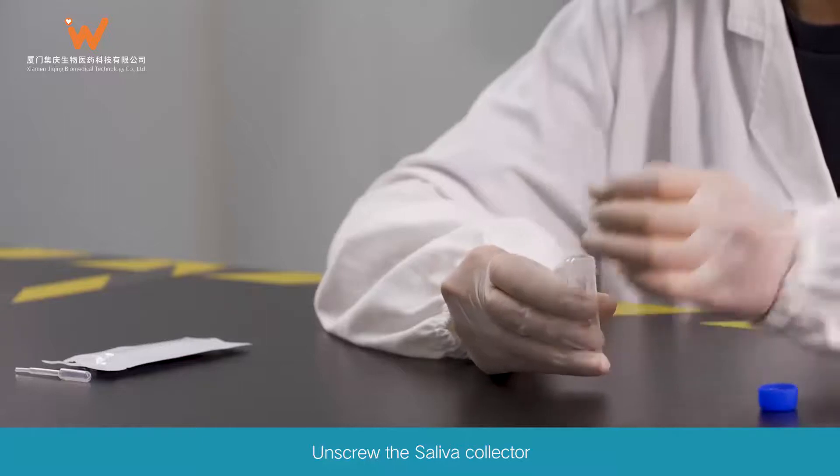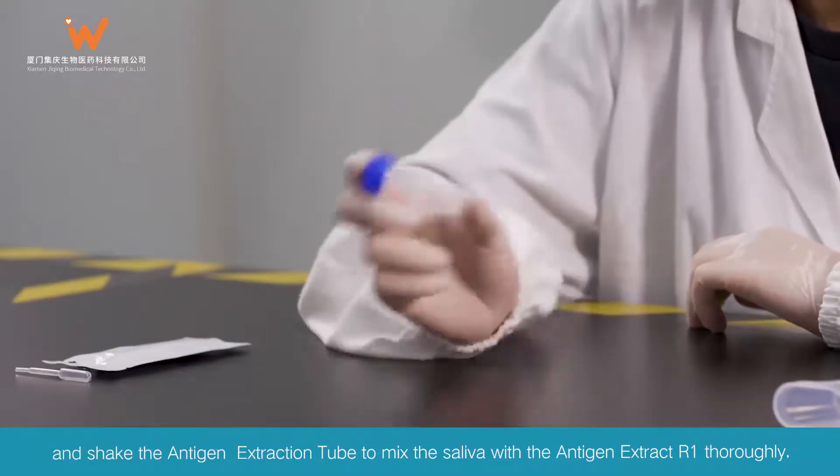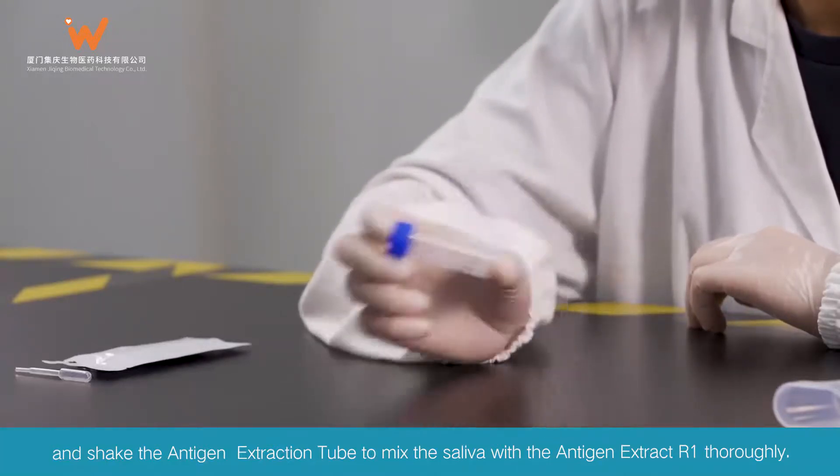Unscrew the saliva collector, close the lid of the antigen extraction tube, and shake the antigen extraction tube to mix the saliva with the antigen extract R1 thoroughly.